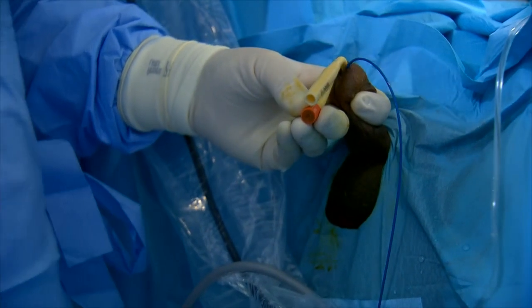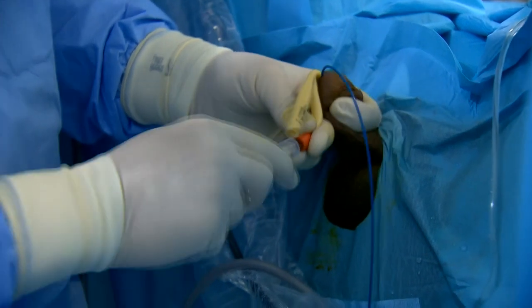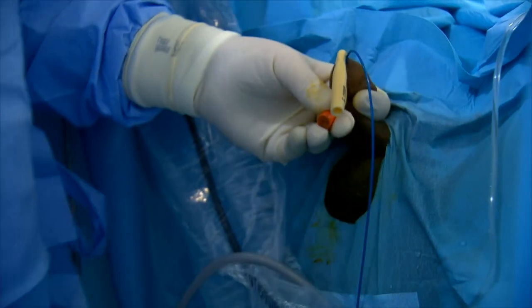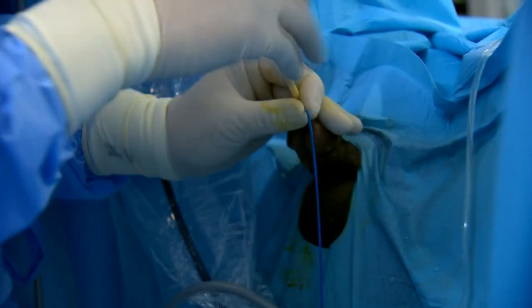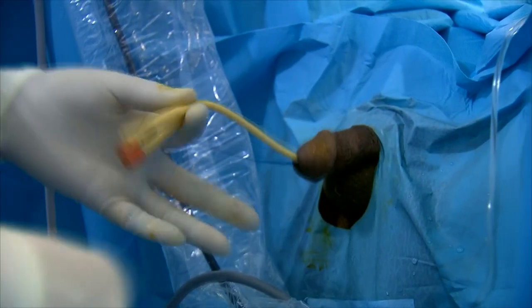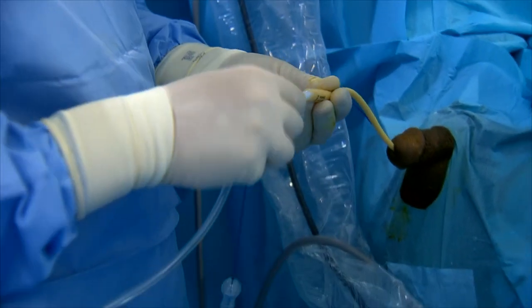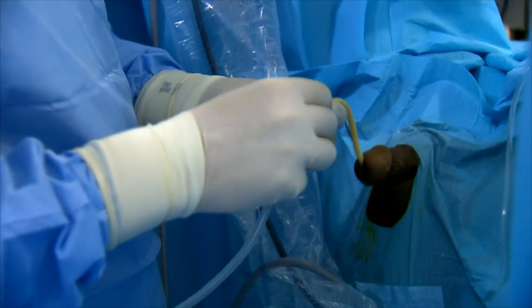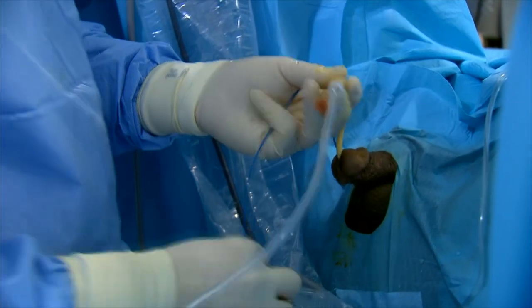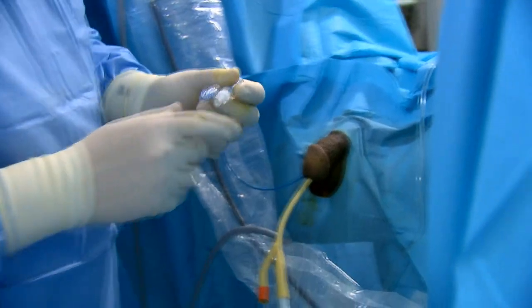Now we are putting the patient in the prone position and performing the mini PCNL procedure. We will bring the ultrasound in. We also don't do any fixation of the ureteral catheter, because at the end of the procedure, maybe we will decide to do a double J stent. So it is better to leave it free at the end of the procedure. I did not hear the comment very clearly because it was not loud enough. But we don't do any fixation of the ureteral catheter to the transurethral catheter.